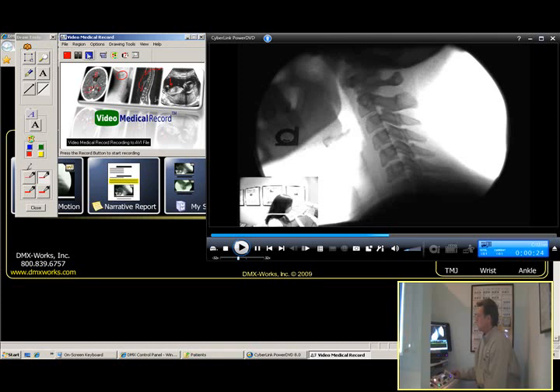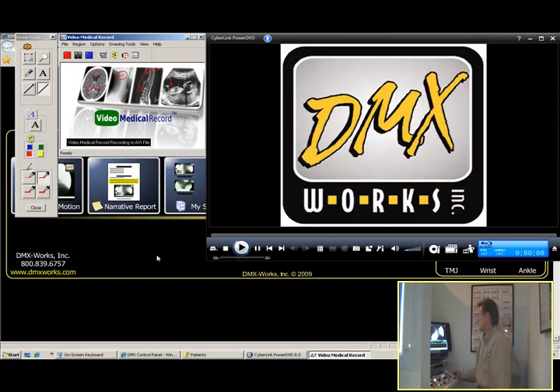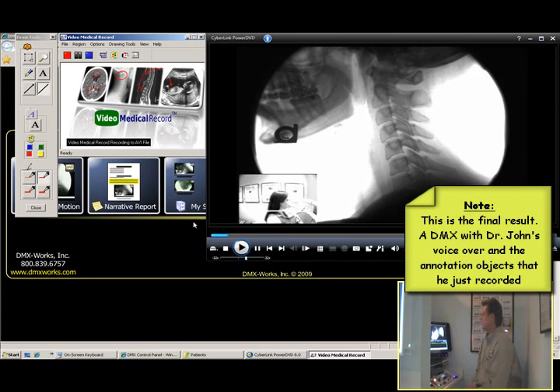We're going to go up here and stop and pause this. We're going to name this Rachel. So I'm going to go ahead and pull my keyboard down here. We're going to go ahead and save this because it is Rachel. And right there — that's going to automatically play up here as the motion x-ray as soon as we push play.